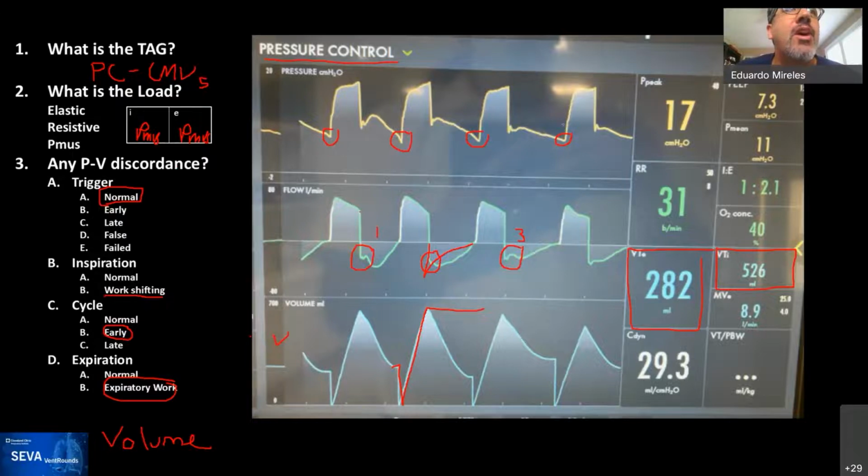So there's a couple of comments from Aman. A positional trach can cause a variable amount of leak, which may vary based on the patient. Absolutely. Thank you, Aman. So tracheostomies or ET tubes or bronchopleural fistulas, if there's patient activity, that will affect the amount of leak that exists.